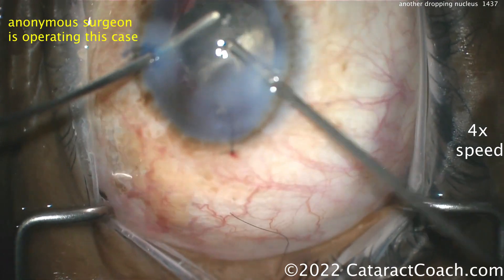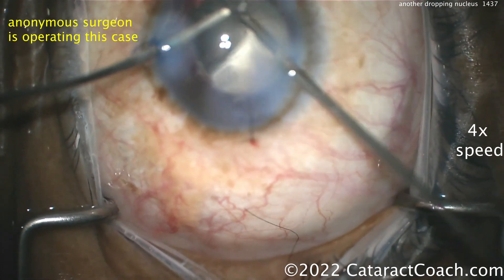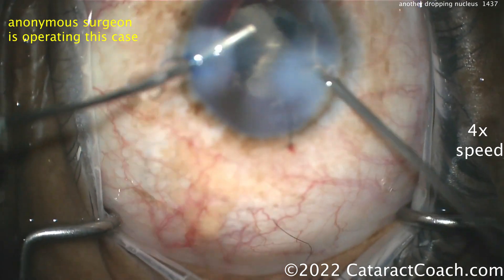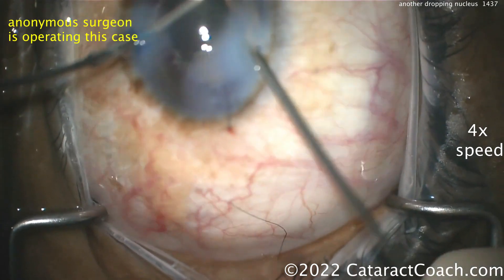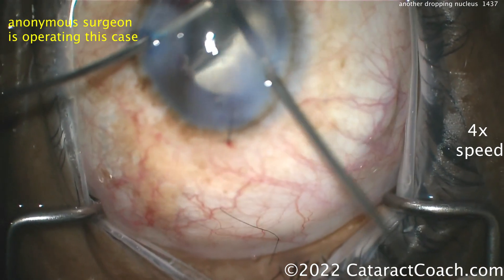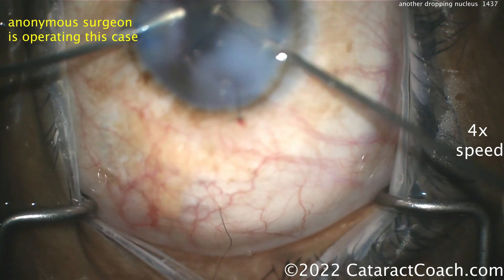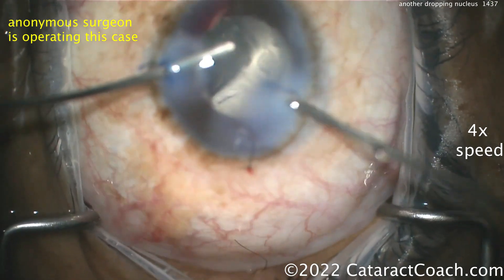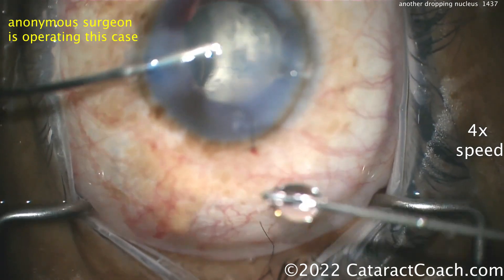Cleaning up at the end — tough case, but remember this happens to all of us. It's not whether or not you get this complication, because I can already tell you you're going to get it multiple times throughout your career. It's how you manage it. Do what's best for the patient: manage it conservatively, clean up, close the eye, and get the patient to your vitreous colleagues. The triamcinolone in the vitreous cavity — leave it; it'll all come out when the vitrectomy is performed by the retina surgeon, and it'll help control post-op inflammation. Watch these eyes carefully because they have a higher rate of endophthalmitis.